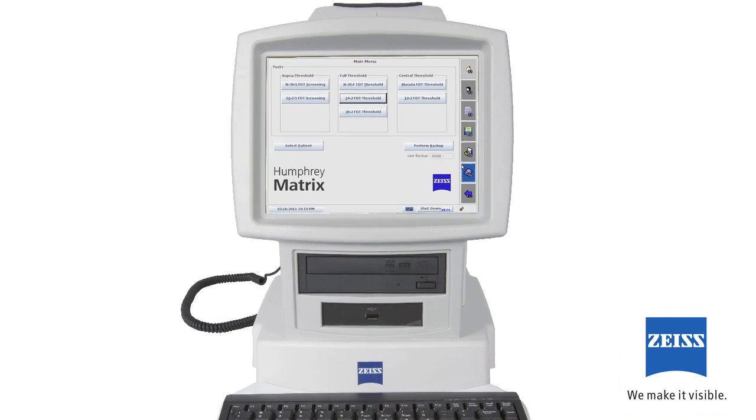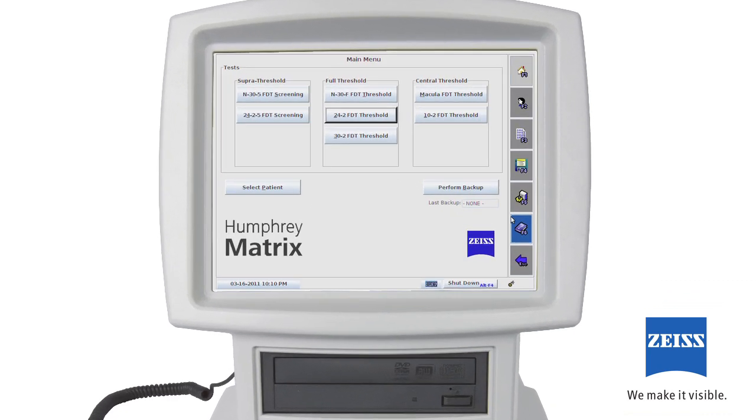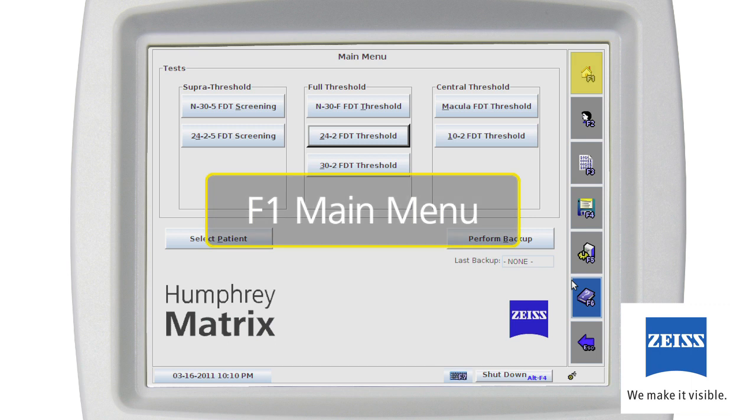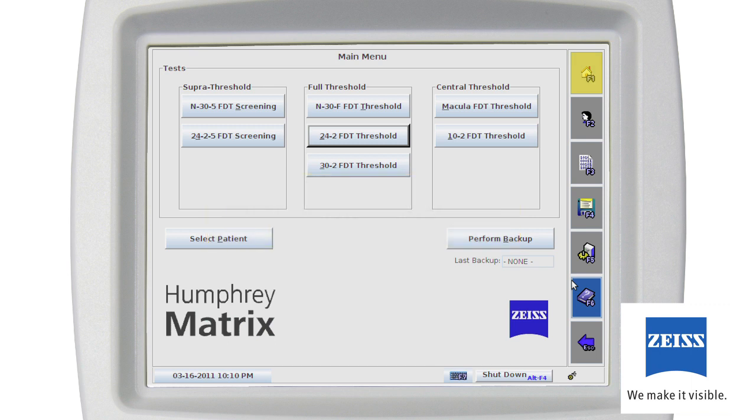Once the instrument initialization is complete, the first screen you'll see on the operator LCD screen is the F1 main menu. This screen allows you to choose all of the tests available on the instrument: screening tests, threshold tests, and central field of view tests. You also have the ability to select by patient. Because backing up patient test data is important, the main menu also has a backup button along with an indicator telling you the date of your last backup.